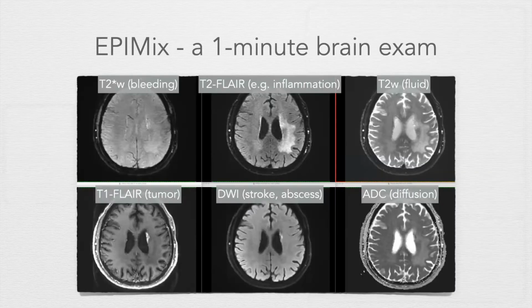So here's how these images can look. As you see, they are noisier and slightly lower resolution than the image I showed before on the big five side. But yet you can still see pathology here.